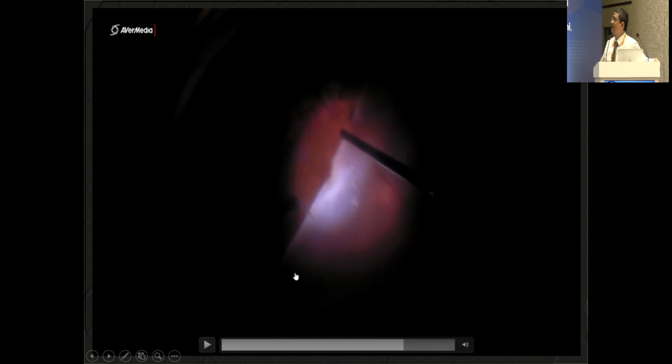And this is the most important part, which I got caught on here: the RPE. The retinal pigment epithelium, along with the blood, lying under this is very difficult. I'll just stop it here for a second. So here the most important part is that you are dealing with liquid blood, a clot, and RPE, and on the other side, the flap is there. You need to understand the fluidics of that, so your fluid should come in such a way that the flap does not flatten much more.